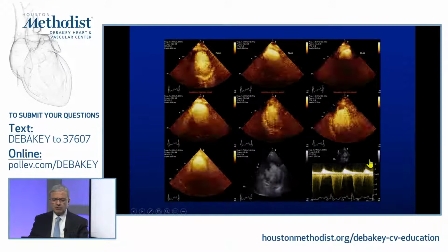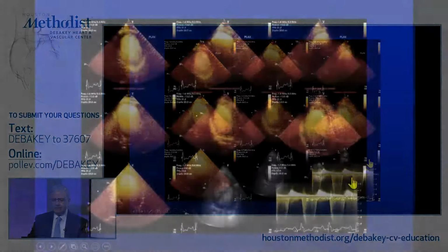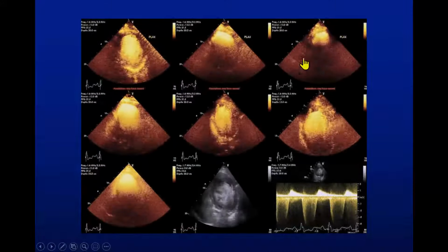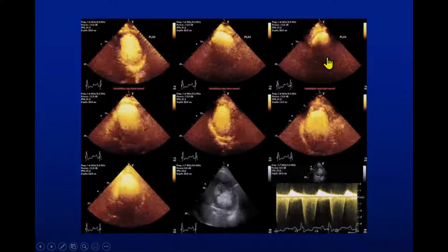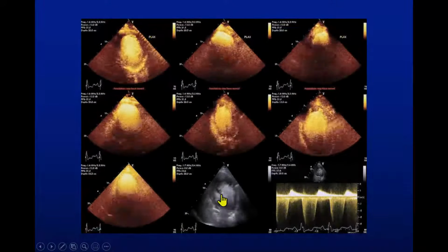And just to close the technical things here, if you will, notice a few things on that same case that I showed you before. This is an example of what? Of attenuation. This is early on. A lot of contrast actually coming in. You could see attenuation behind it, so it's not too little contrast. You can see the thrombus, still attenuation here, and this is what?